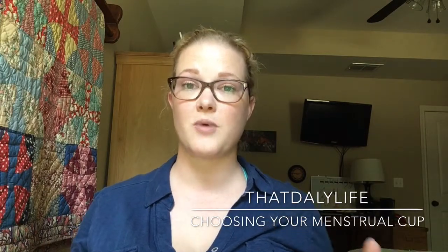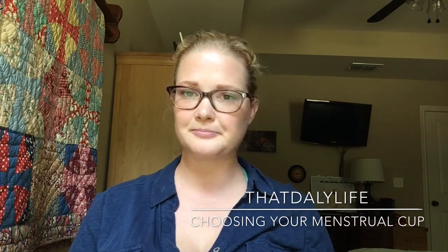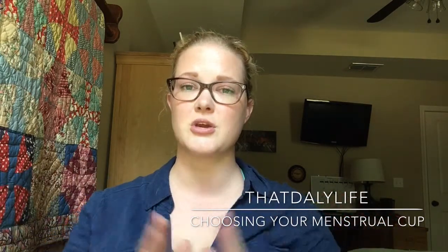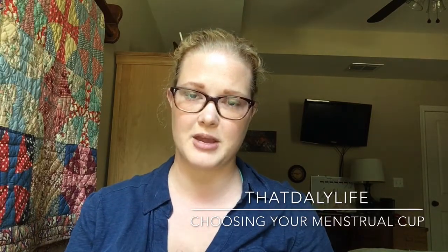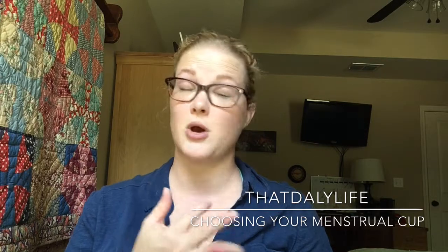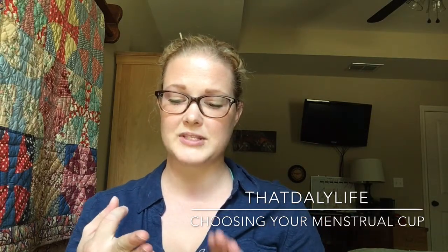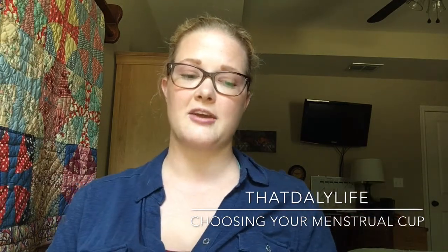So you might be a little overwhelmed when you look, especially online, at the world of menstrual cups and where to start. You need to turn that off for a second, because first you need to figure out how high your cervix is to determine what size cup, because there are totally different shapes and brands, and then there are different sizes as well. Your first stop is knowing what size, and to do that you're going to need to measure your cervix.